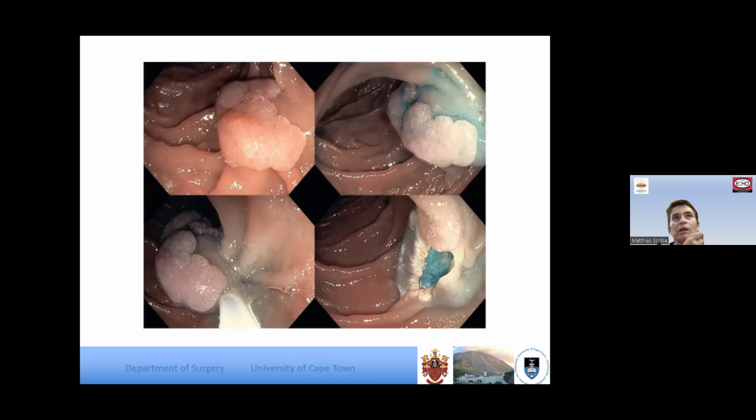Again, as Matt said, the trick here, especially in the duodenum, the wall is thinner than the stomach. So when you do snare that adenoma, make sure you move your snare up and down to make sure that you do not have the entire wall of that duodenum moving with you, because then you know you've caught some muscle tissue with you. And as Matt said, that dye that you put in just beautifully differentiates your mucosa from your deeper layers.